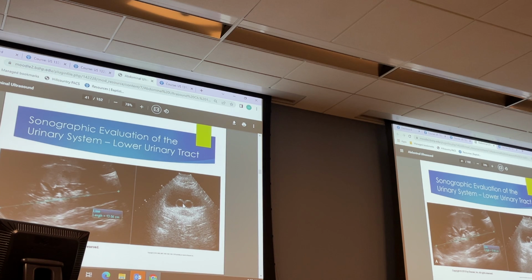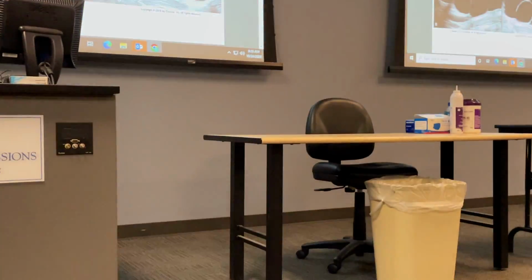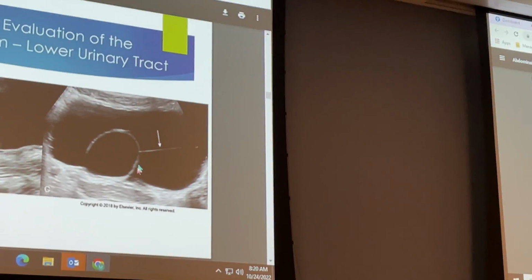Okay, so again, what are these double echogenic structures within the bladder? Again, those are bilateral ureteroceles. Okay. Here again, we are seeing a ureterocele. You can see a ureteral jet going off. That's that echogenic line that is being pointed to here, but a significant size ureterocele.